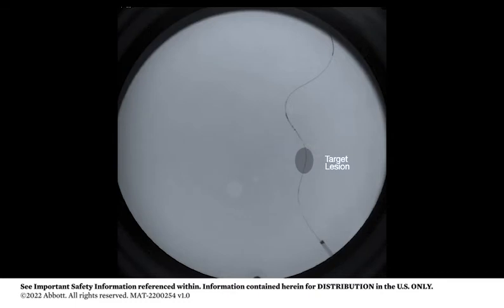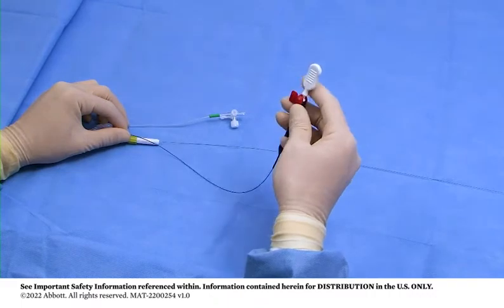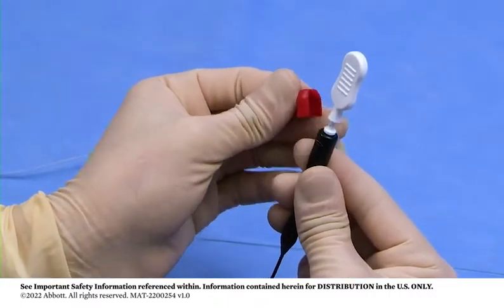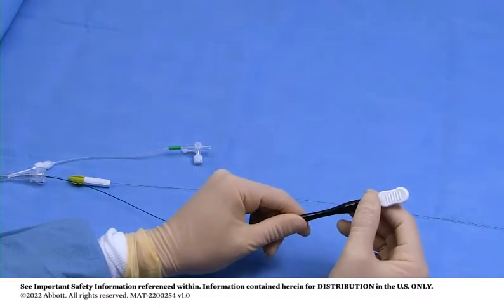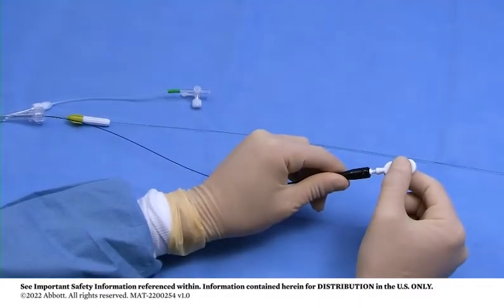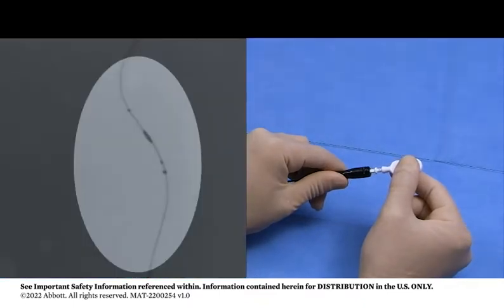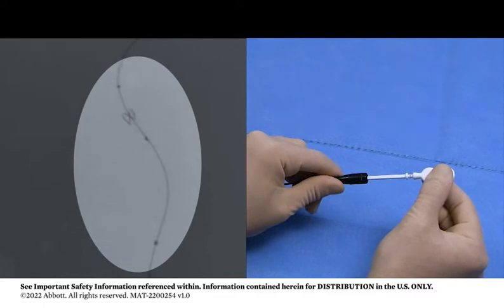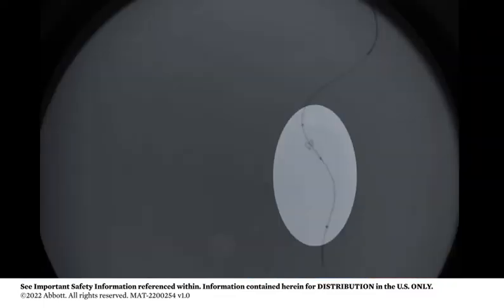Once the delivery catheter is positioned, the filtration element may be deployed. Remove the red locking clip from the black handle of the delivery catheter. Hold the black handle steady and pull back on the white pull handle to deploy the filtration element. Deployment is occurring when the distal marker band on the delivery catheter moves proximally away from the marker bands on the filtration element. Verify the filtration element placement and assess perfusion.